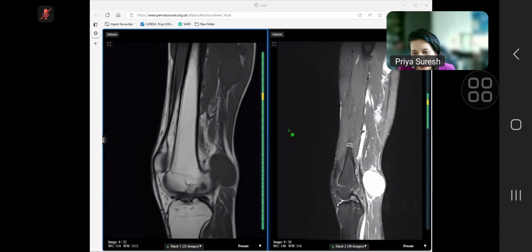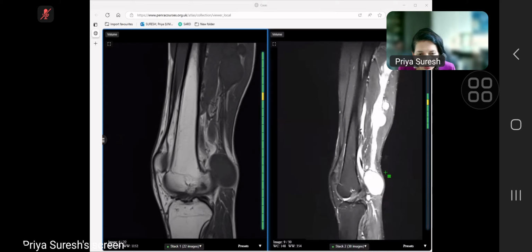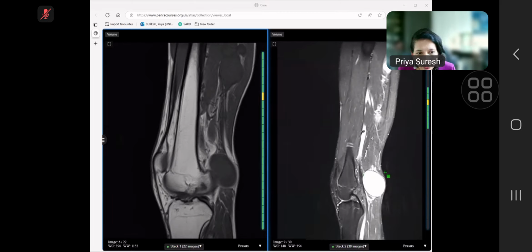The other thing that examiners are looking for is a little more detail about the pathology itself. So yes, it could be neurofibromatosis. The other thing is schwannomatosis. In this case it was schwannomatosis, but it's difficult to distinguish it clearly just based on the imaging, but that can be a differential that you offer.